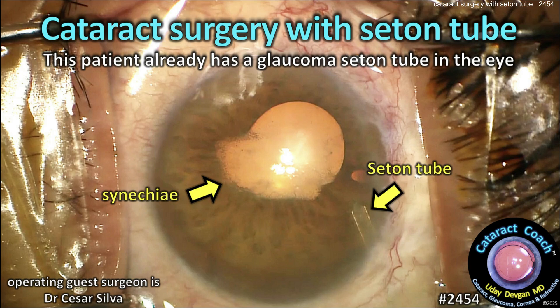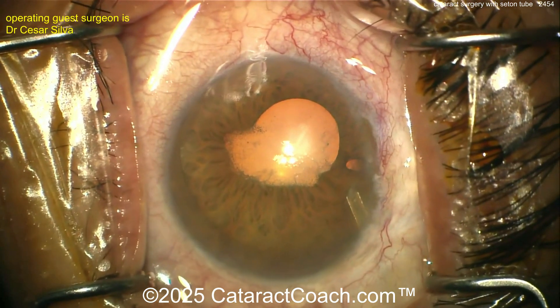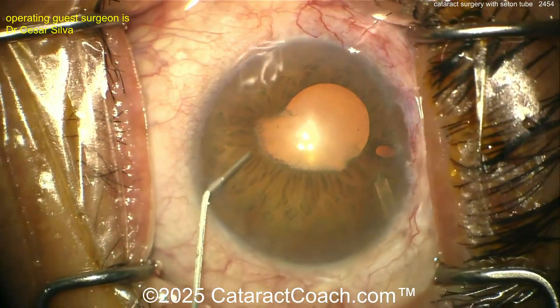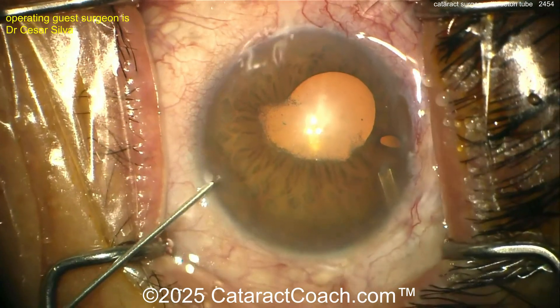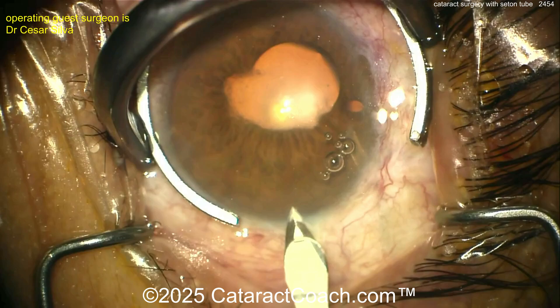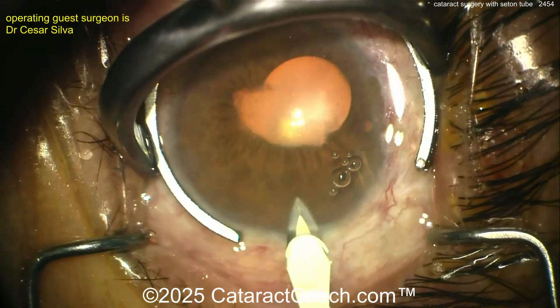CataractCoach.com — cataract surgery with a seton tube. The patient already has a glaucoma seton tube in the eye. You can see there's a lot of synechiae of the iris under the anterior lens capsule. There's a peripheral iridotomy on the right-hand side of your screen at the patient's 12 o'clock, and in the superotemporal quadrant there is a seton tube, probably an Ahmed valve.